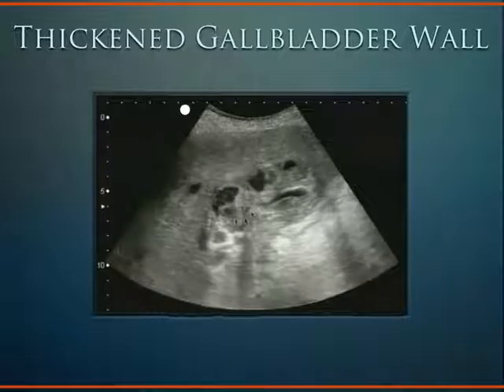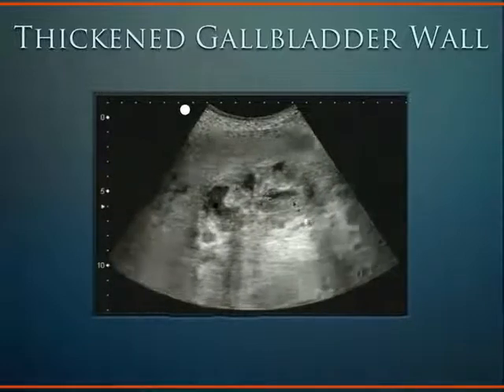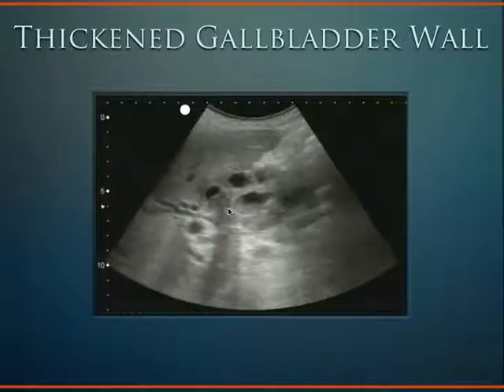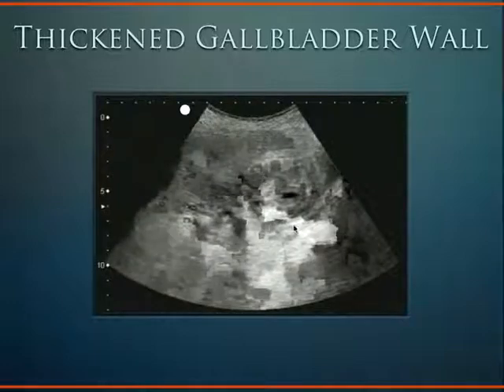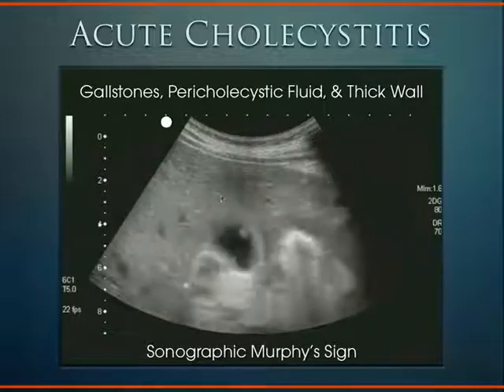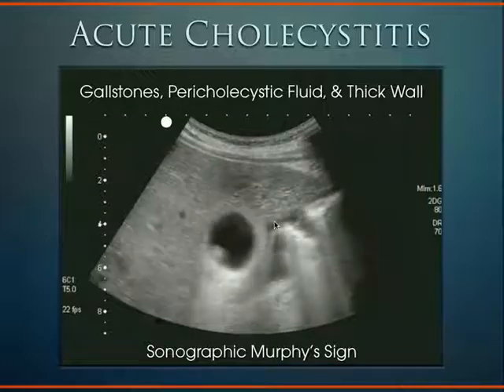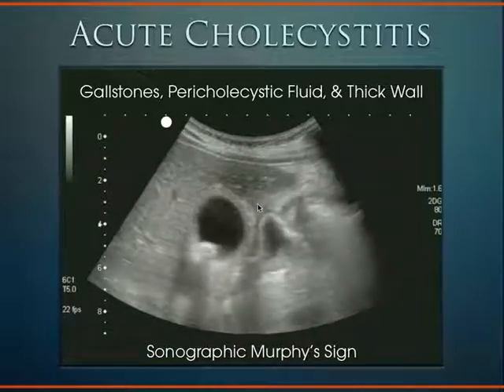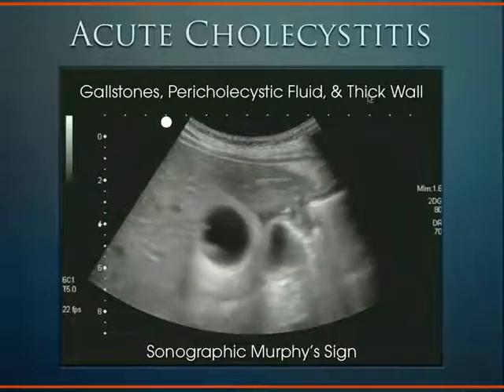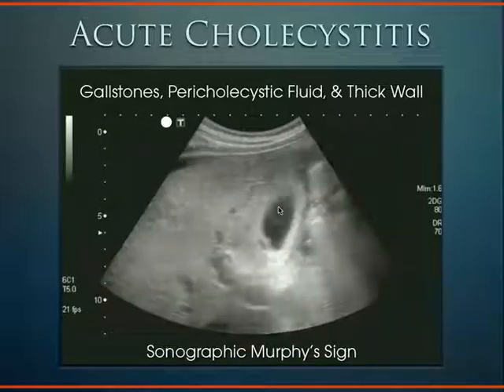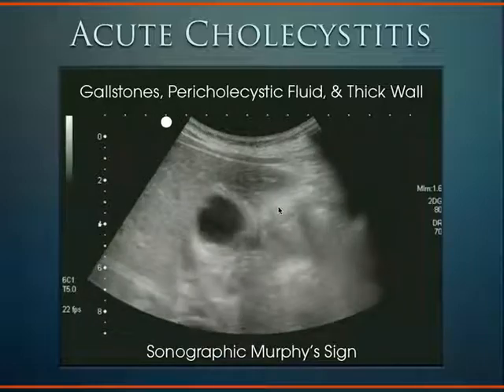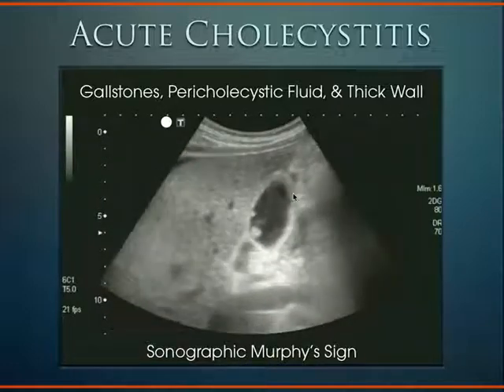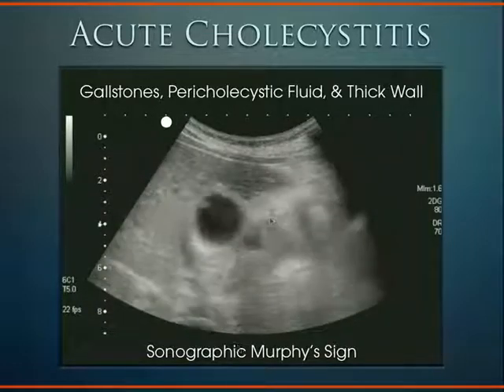We can see a stone here as we fan through. This is probably the coolest gallbladder in my collection — we see the very thickened gallbladder wall as we fan through in short axis. Here's another: a very thickened gallbladder wall, an echogenic stone with shadowing, and also some pericholecystic fluid — pretty rare to see but exciting. A wedge of fluid is seen adjacent to the gallbladder. Together — gallstones, pericholecystic fluid, thick wall — and as you lean the probe into the patient's gallbladder and they say 'right there, that's the exact pain,' that is a positive sonographic Murphy sign, very specific for cholecystitis.